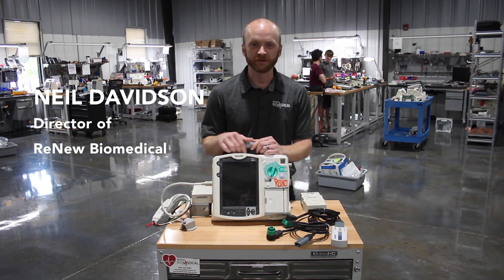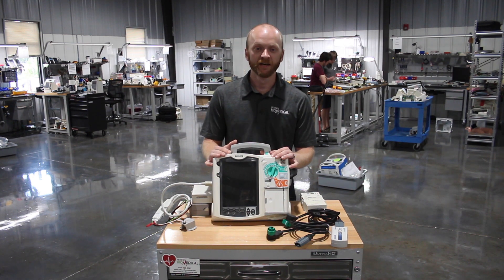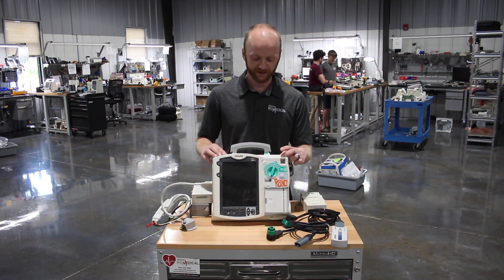I'm Neil Davidson, the director of Renew Biomedical. Philips has end of life, end of support on the Philips MRX. I'm going to be going over some of the ways to know that it's been updated for the FCOs that they implemented.